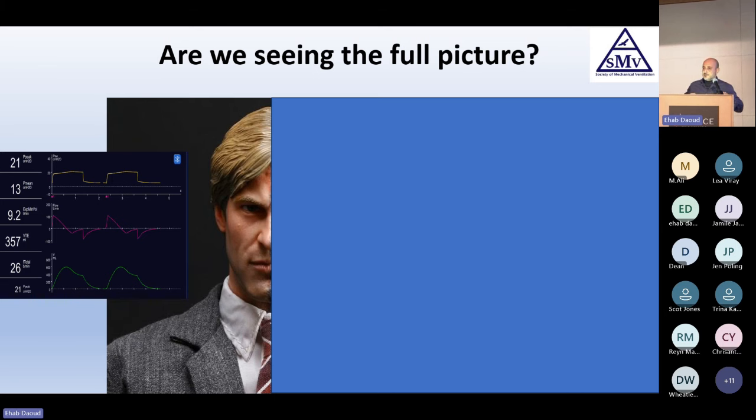It's basically a belt with electrodes, usually about 16 to 32. You strap them on the chest between the fifth and sixth intercostal space, and they send electrical impulses, two at a time, as you can see in that video, and the rest of the 14 detect them and convert them into an image that almost looks like a CAT scan image. So it gives you an active image, inspiration and expiration, during each breath.